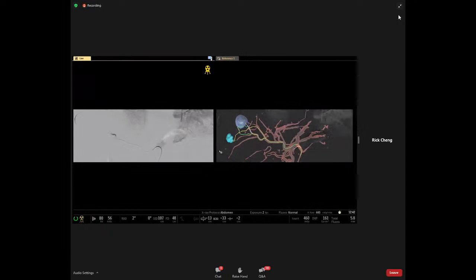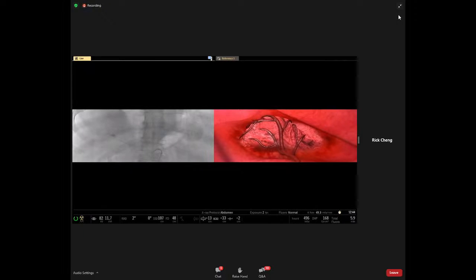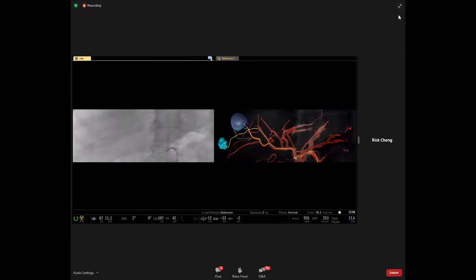When the microcatheter is in place, an acquisition is made to check if the catheter is in the correct position to embolize. Contrast material and the embolization beads are administered to the tumor tissue. Since multiple tumors are identified with EmboGuide, it's easy to go to the next lesion after the first tumor has been embolized.